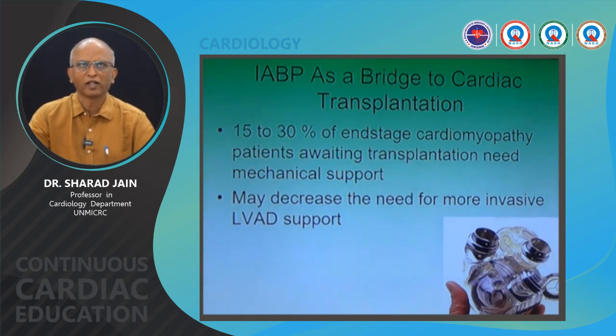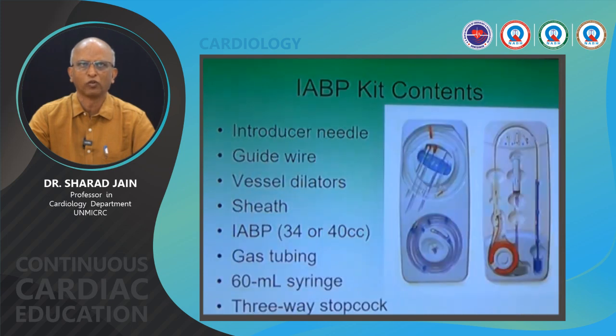IABP is a bridge to cardiac transplantation. 15 to 30% of the end stage cardiomyopathy patients awaiting transplantation need mechanical support. This may decrease the need for more invasive LVAD supports.